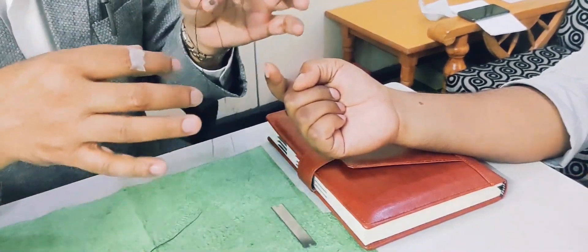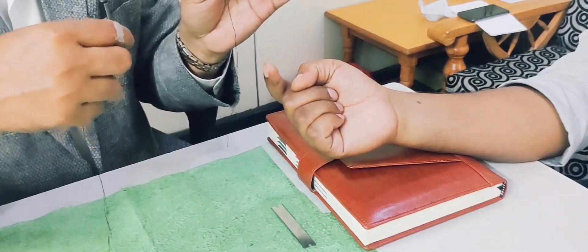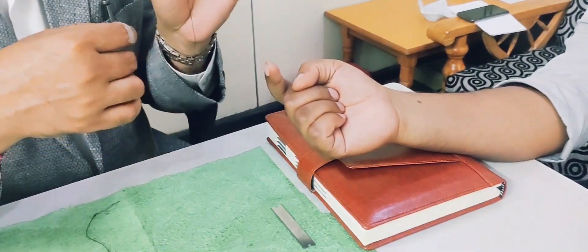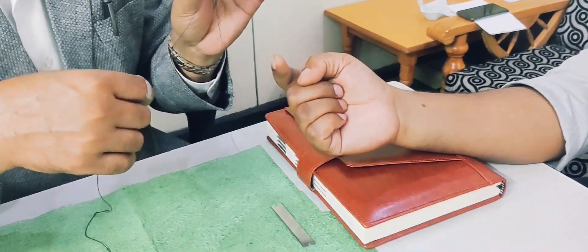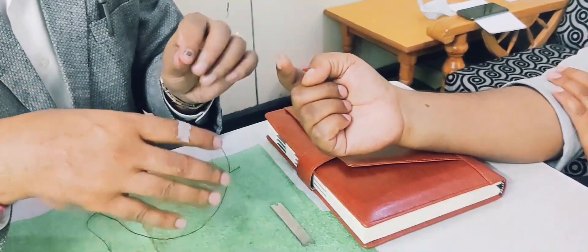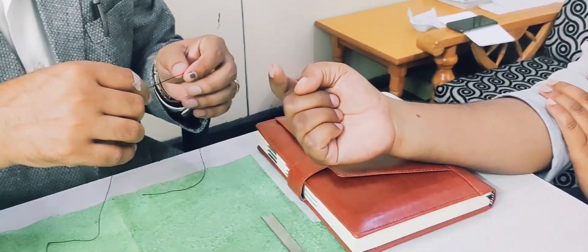Here I am using silk. It is a thick thread, it is non-absorbable which is going to be a knot. Let us start.